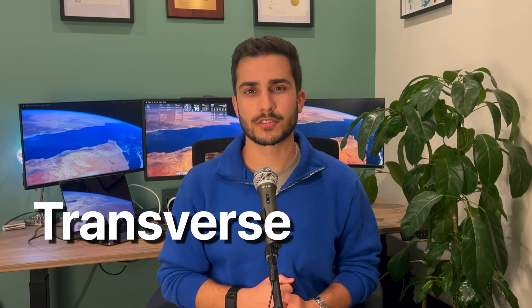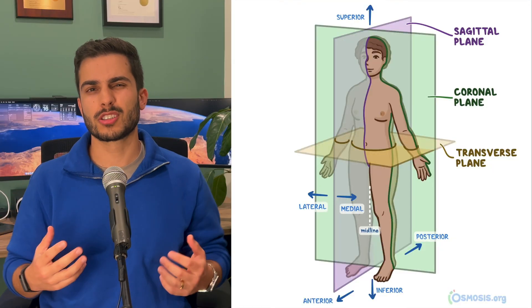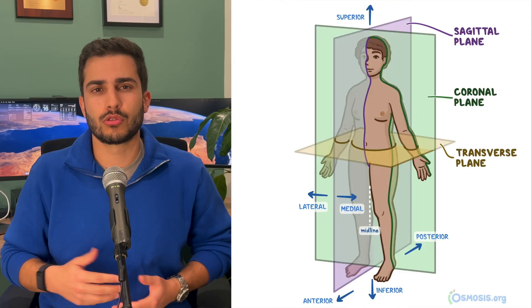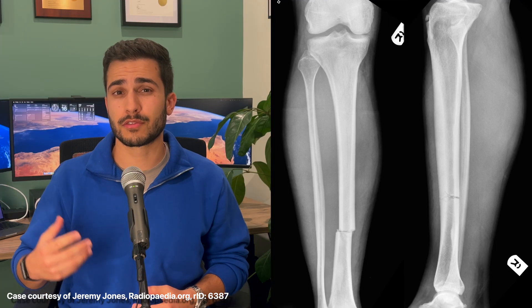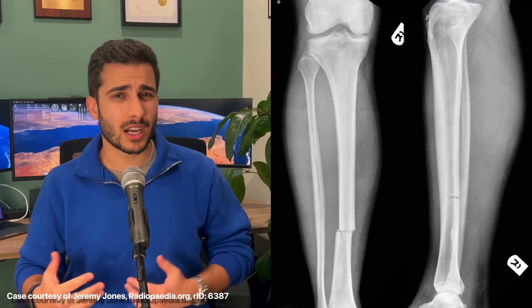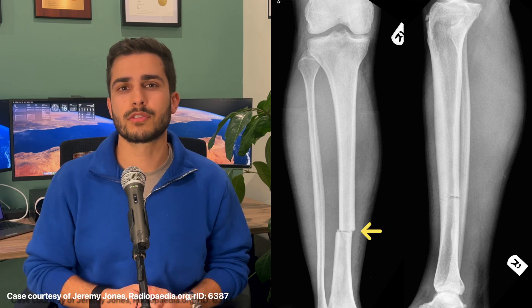Let's start with the transverse fracture. The word transverse refers to one of the three different anatomical planes, usually called axial but sometimes also called horizontal or transverse plane — basically describing a cut that divides the anatomy into superior and inferior parts. So a transverse fracture is characterised by a transverse line through the bone. Here's an example where the patient had a football injury and you can see the line going right through the distal half of the tibia.